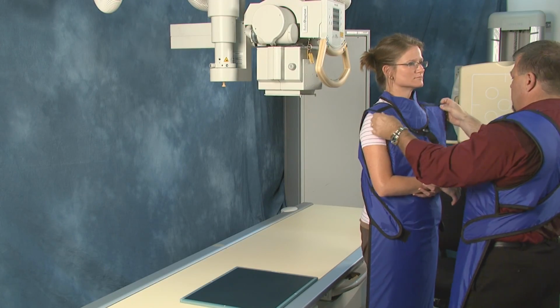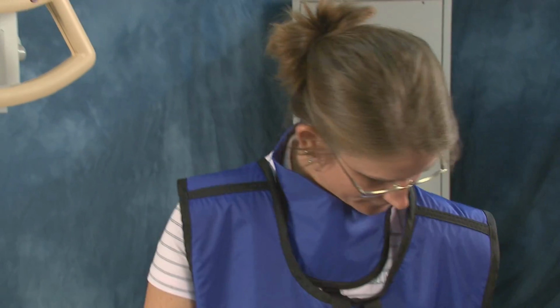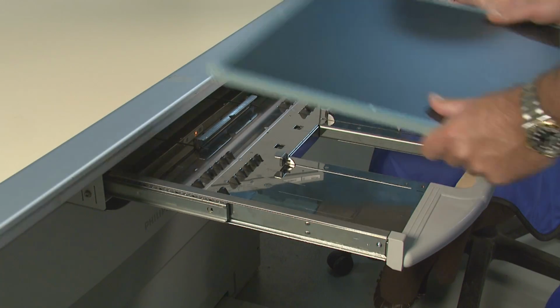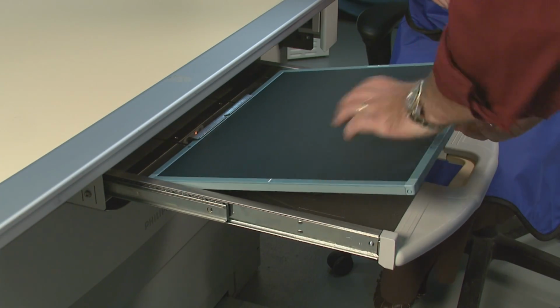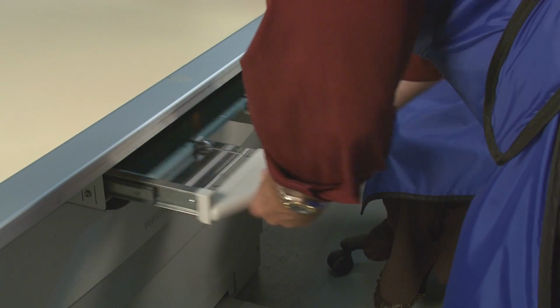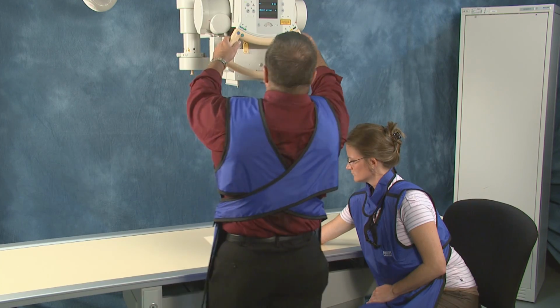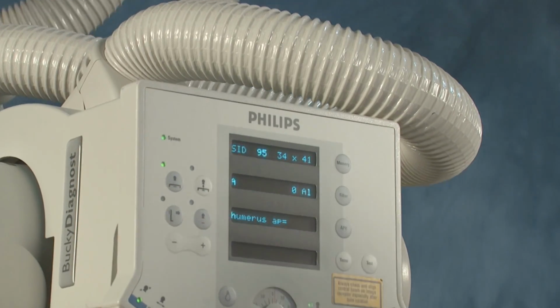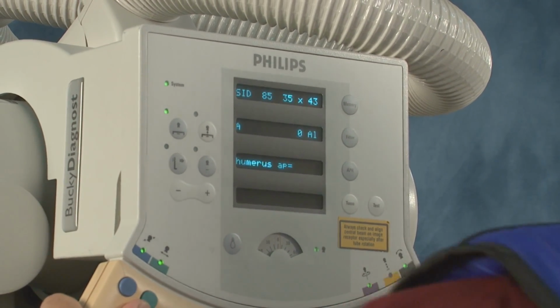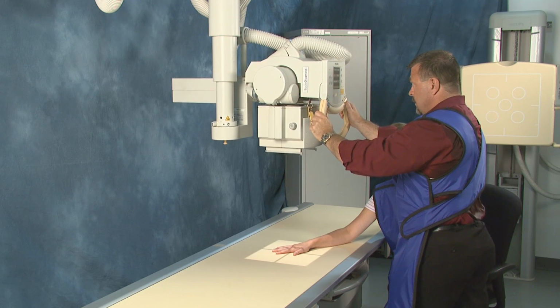Here we have a fairly typical X-ray system and a patient with a suspected broken bone. Our technician starts by placing either a film or digital receptor into this tray, commonly known as the bucky. Next, he adjusts the position of the tube, ensuring that not only is the right part being X-rayed, but that the standard 40-inch distance from tube to receptor is maintained.